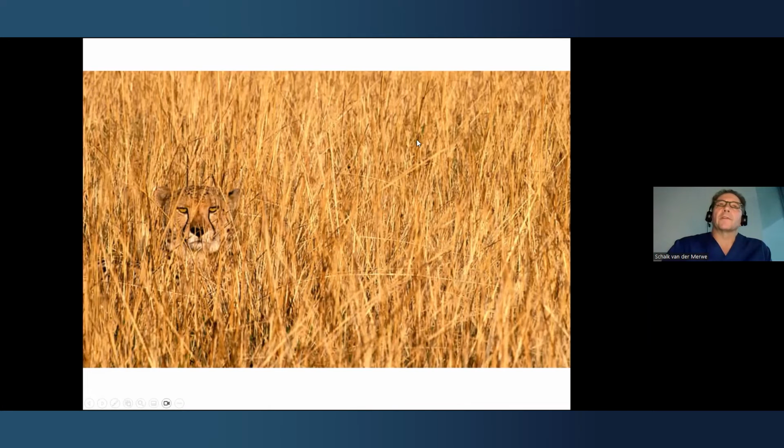So I think the first objective is for the endoscopist during training to recognize what is normal and to recognize what stands out from the normal background, and to identify that as the abnormality. Fortunately, in most cancers, the abnormality will be recognized as a hypoechoic structure against a more hyperechoic background.